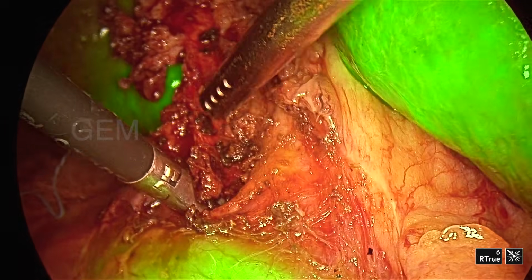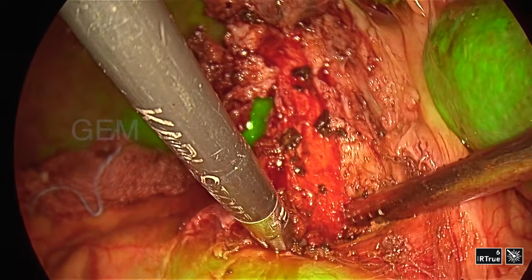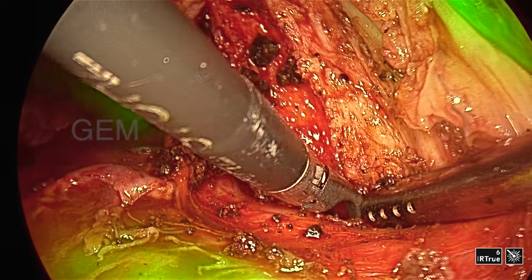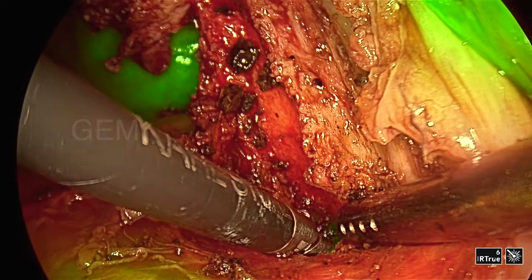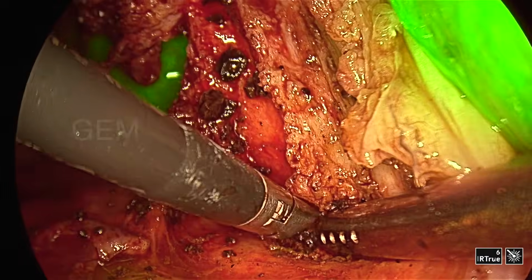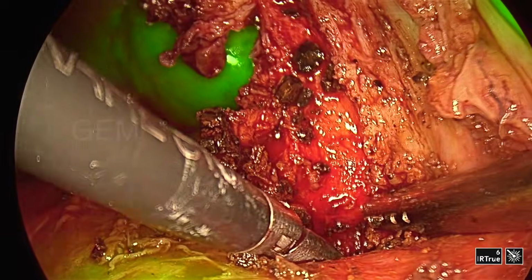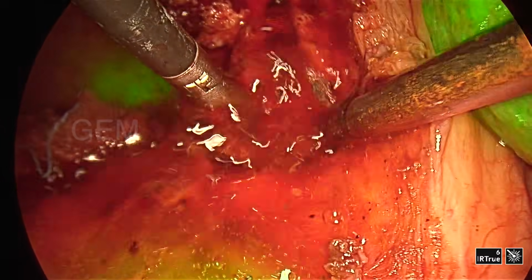So now it is coming out slowly. If it is a CBD stone, it will come by milking out, but this is at the junction, the curvature area of the cystic duct. It will not come by milking it out or pushing down. Now you can see the bile is coming out. That means where I am removing the stone, if you see clear bile coming out, then all the stone is being removed. The entire stone is removed.